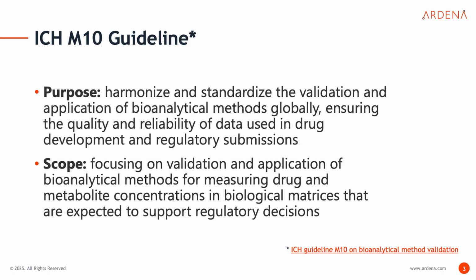The ICH M10 guideline is a globally harmonized standard developed by the International Council for Harmonisation. It will focus on the validation of bioanalytical methods and the analysis of study samples. The goal is to ensure that data used in regulatory submissions, whether for new drugs or generics or biologics, is always accurate, reliable and reproducible.